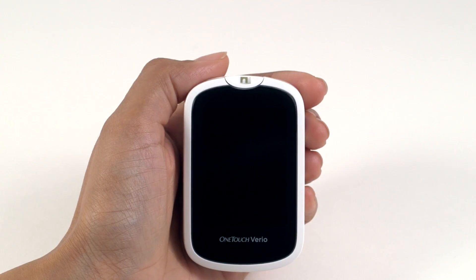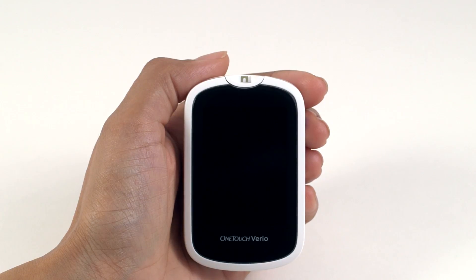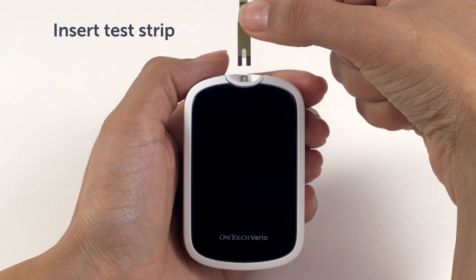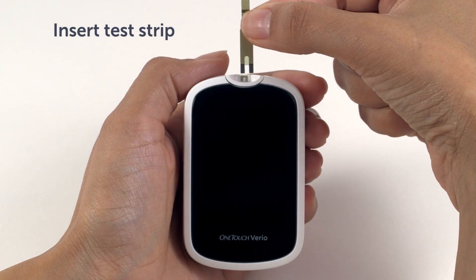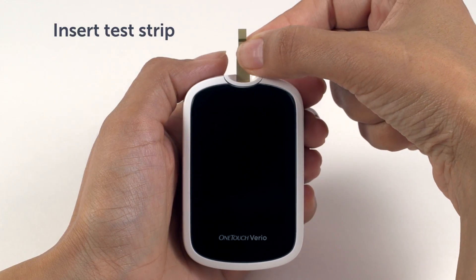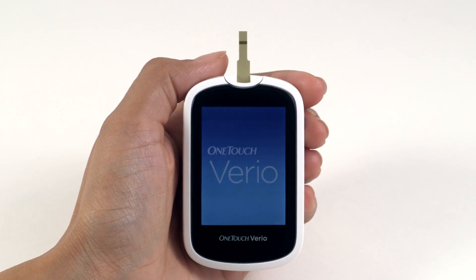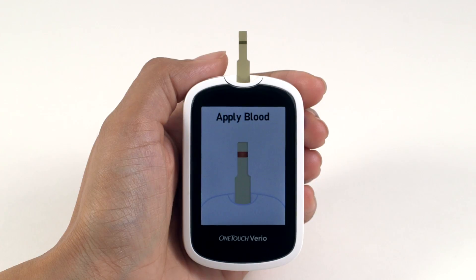First, let's prepare the meter. Make sure that your meter, test strips, and control solution are at the same temperature before testing. Take one of your OneTouch Vario test strips and insert it into the meter test strip port, making sure that the gold side of the test strip and two silver prongs are facing you. Wait for the Apply Blood Screen to appear on the display. The same Apply Blood Screen that appears during a blood glucose test also appears for a Control Solution test. The meter is now ready.